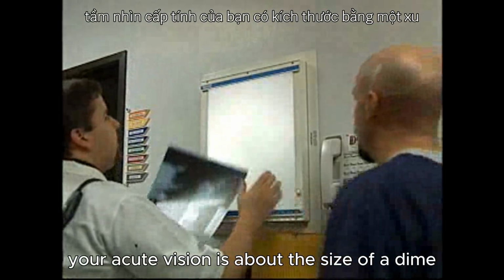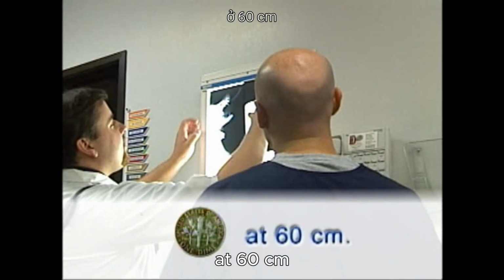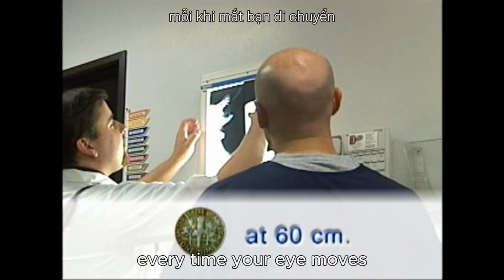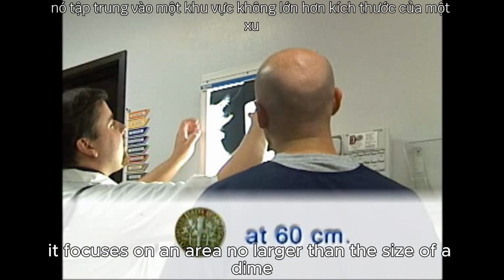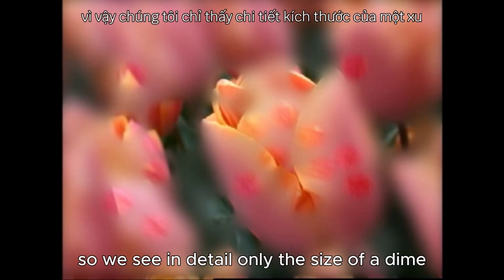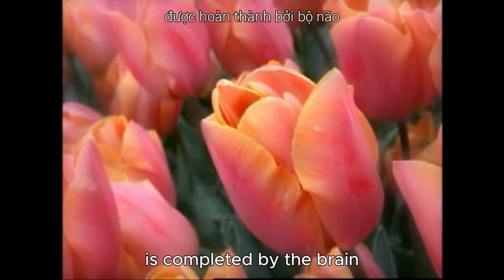The size of your acute vision is about the size of a dime, at 60 centimeters, the distance one might typically view radiographs. Every time your eye moves, it focuses on an area no larger than the size of a dime. Our eyes constantly move and jump from one part of an image to another, so we see in detail only the size of a dime. The rest of the image that was not seen by the fovea is completed by the brain.